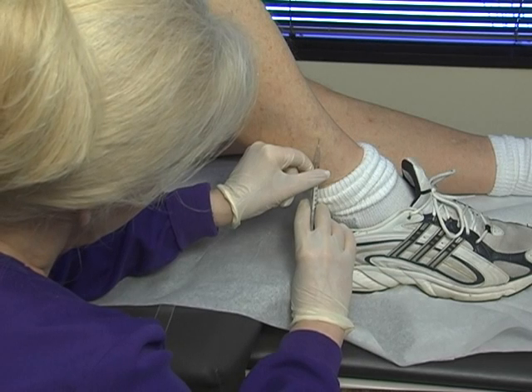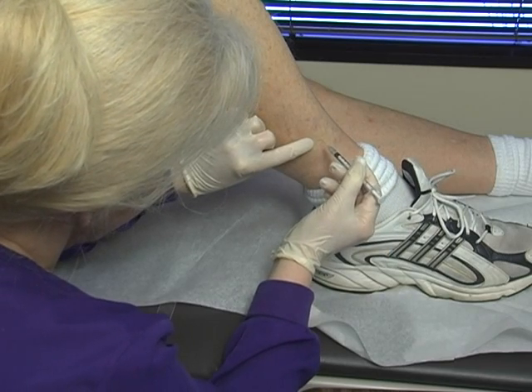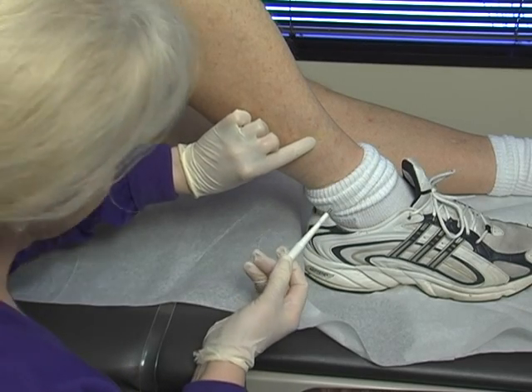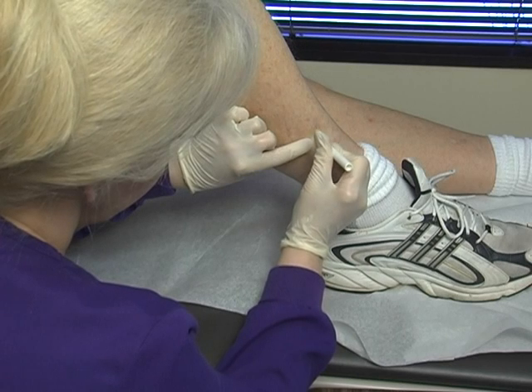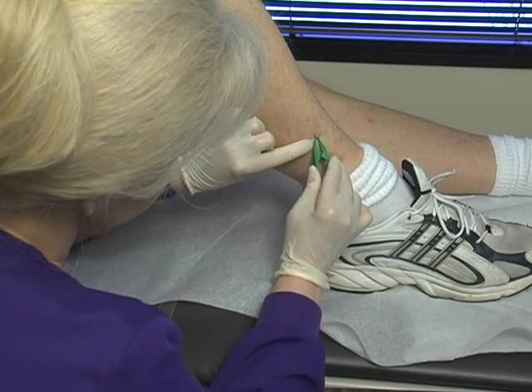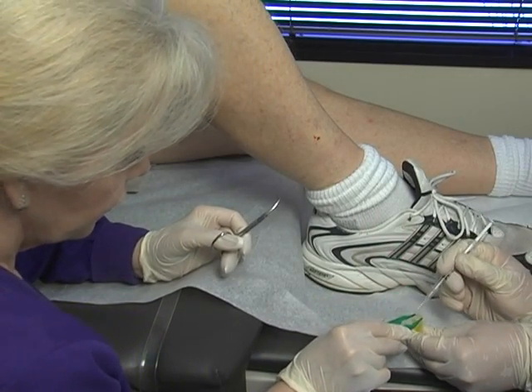If you go a little too deep, they can still feel pain, so you want to go as close to the skin surface as possible. With Bob's coloring, it's a little more difficult in the lower extremity to actually see that bleb — that's why I'm holding my finger on that spot. Gentle rotation and pressure at the same time. Again, being very careful to reach under the specimen and lift up — not squeezing from the top and damaging our tissue. Lynn's going to use the end of the needle to transfer the specimen.